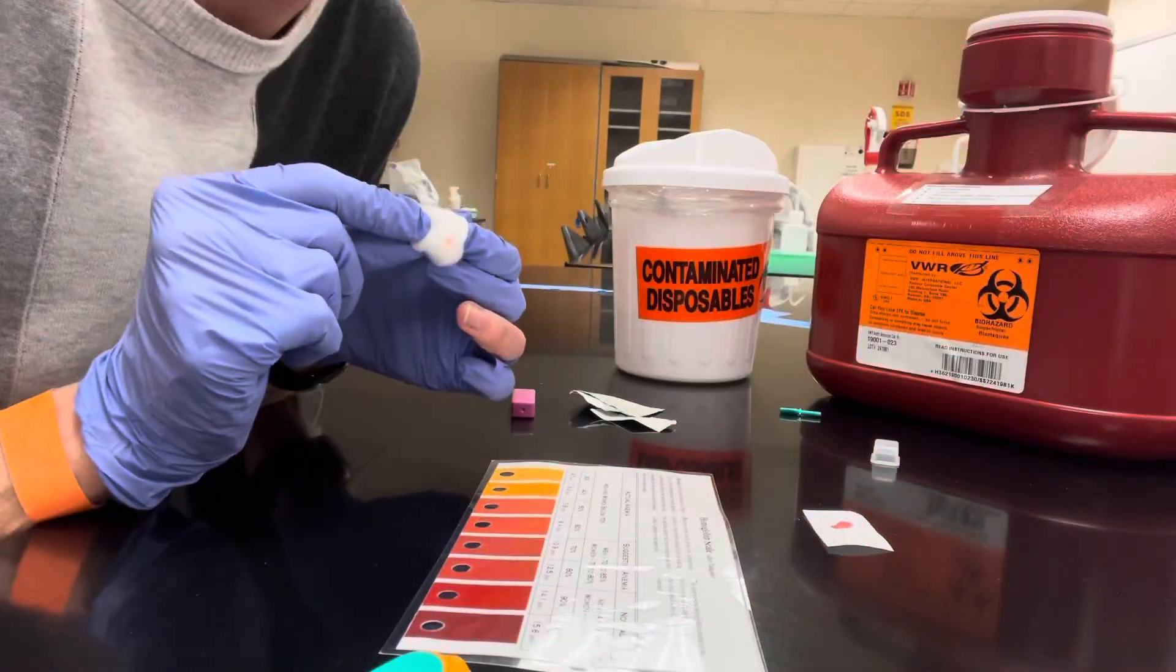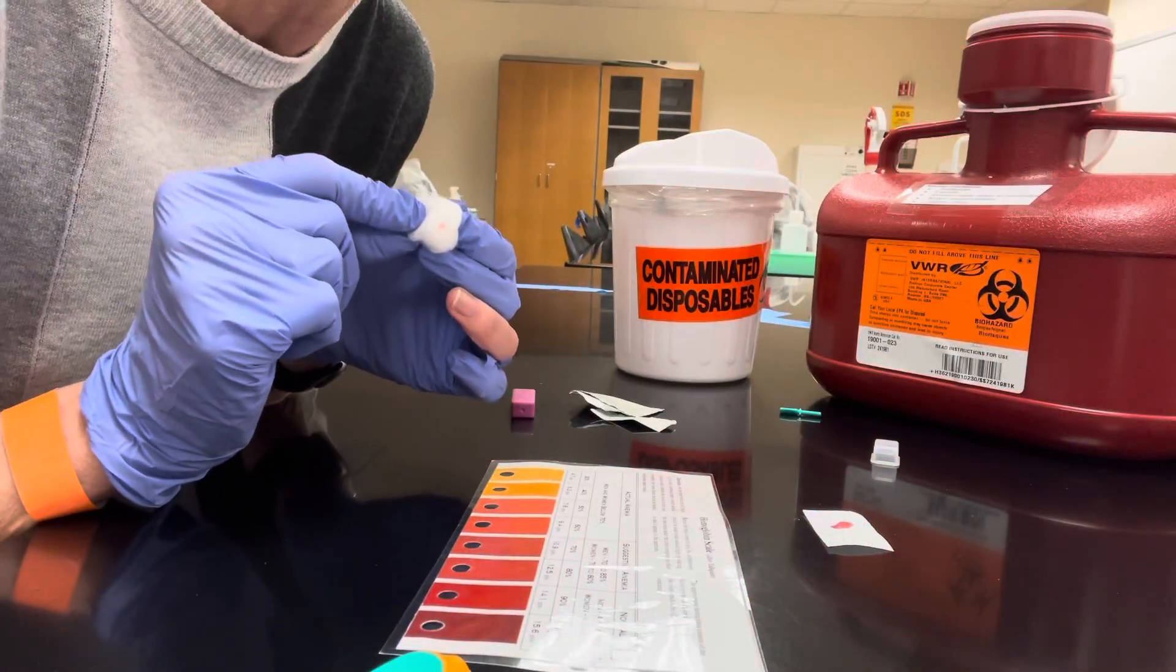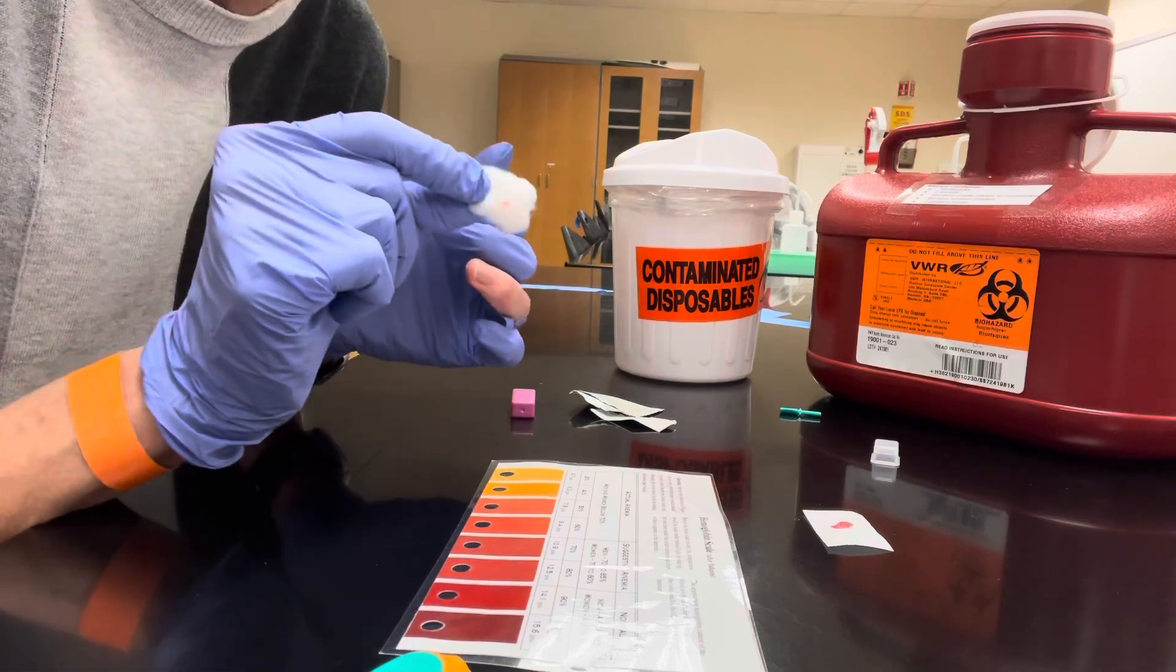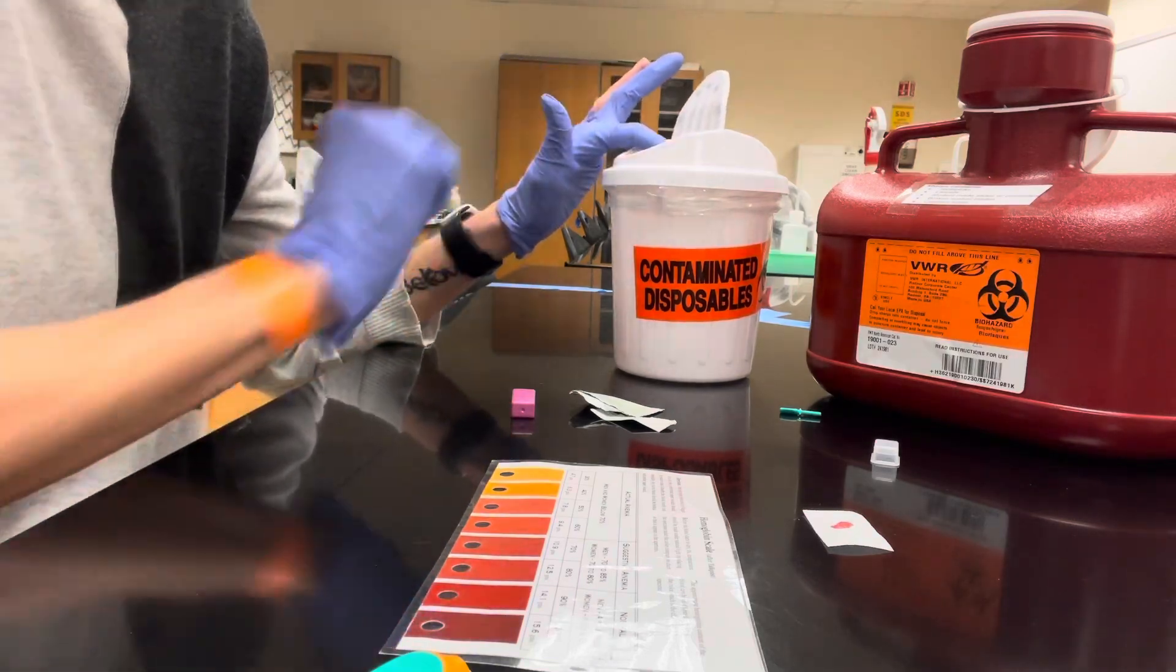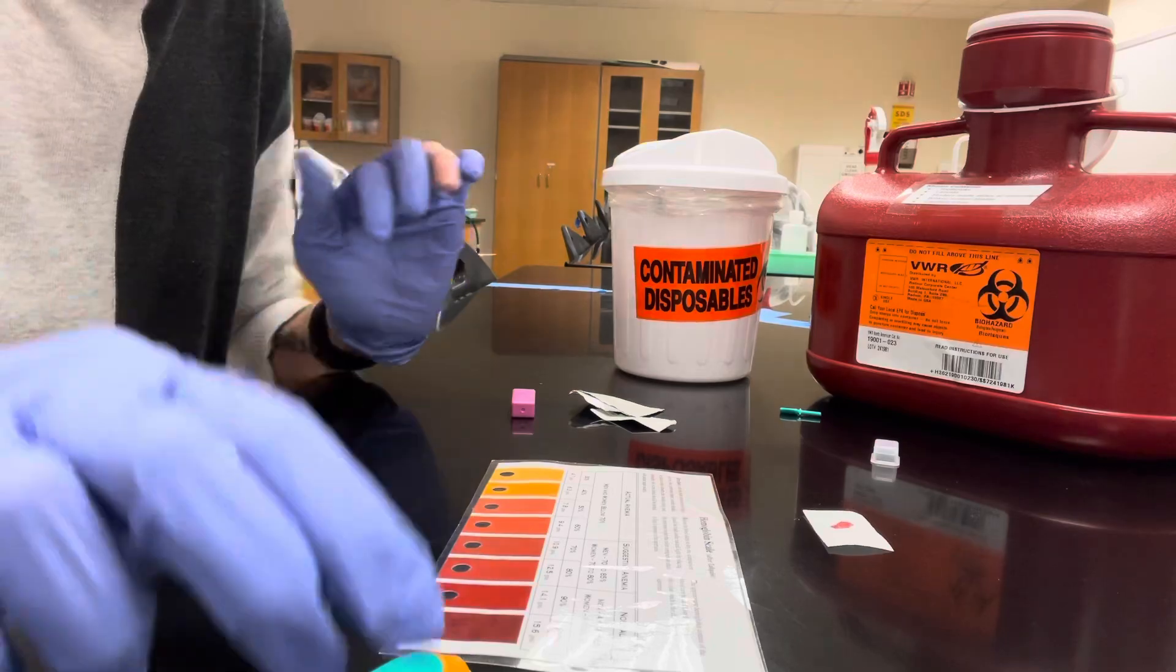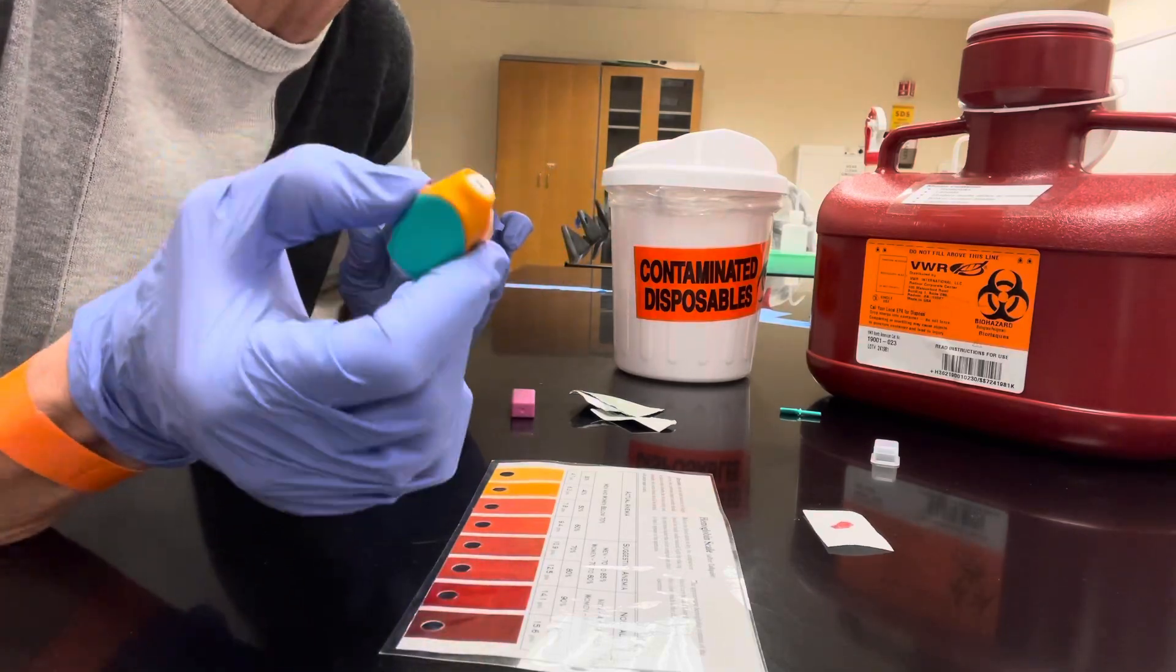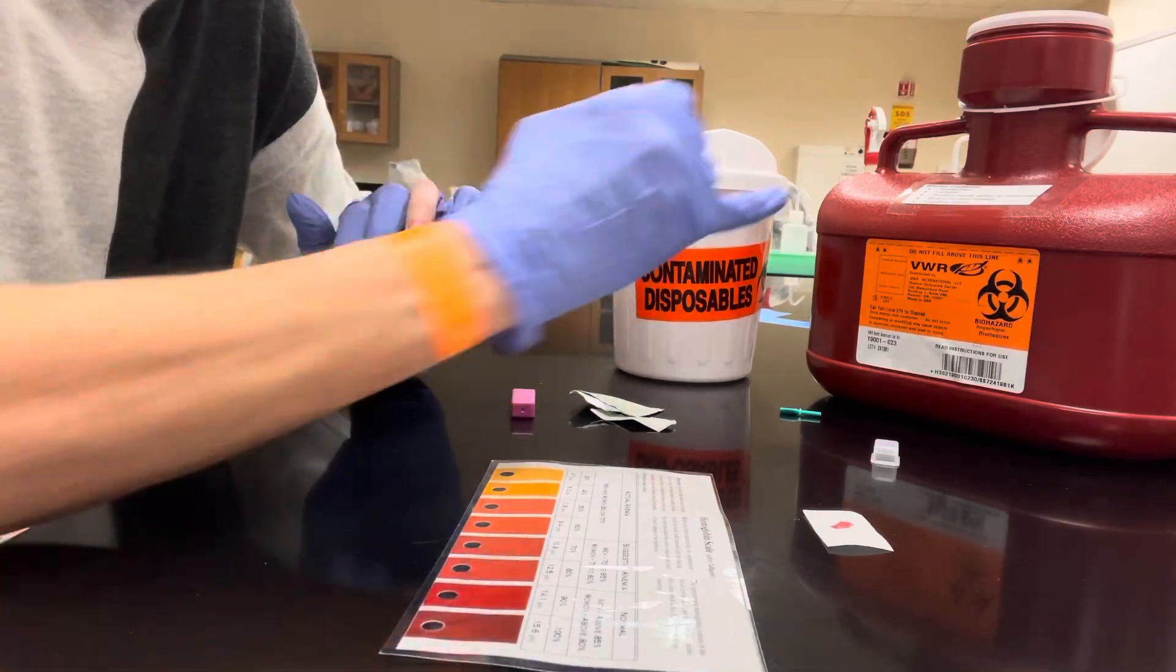Make sure to dispose of your biohazard waste material in the proper container. Soft things go in the small biohazard cans. And remember, things that are sharp and pokey are going to be discarded in the sharps container.